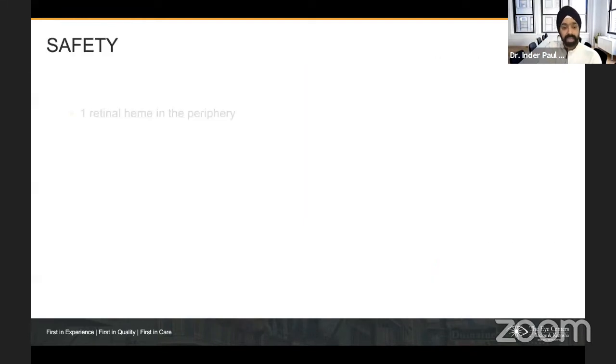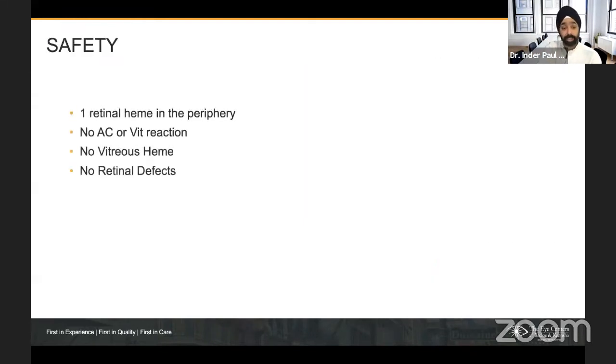But in terms of safety, we found I did hit the retina, and I'll show you a video on that. And the good news about hitting the retina is, if you hit the retina periphery, it'll go away and you should not see an adverse event long-term. But the retina you hit is not because the laser's unsafe, it's because you as a surgeon have to know how far back you're able to fire. And that took me a few sessions to figure out.